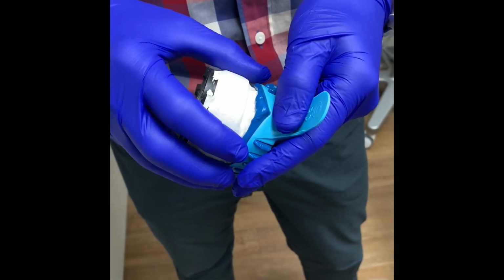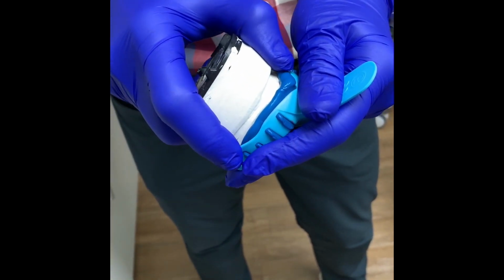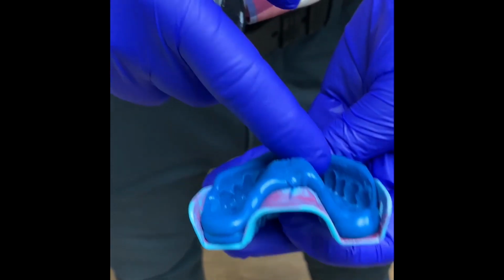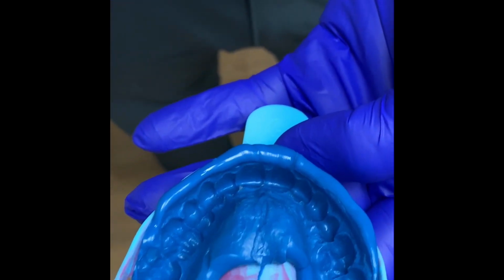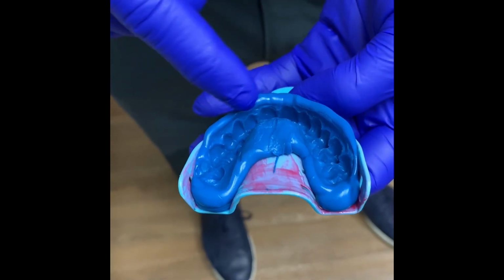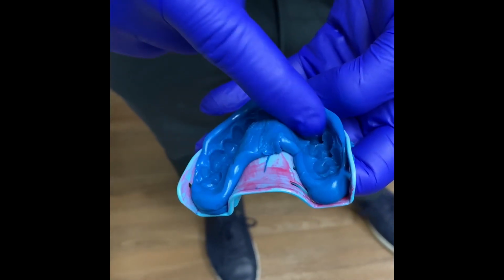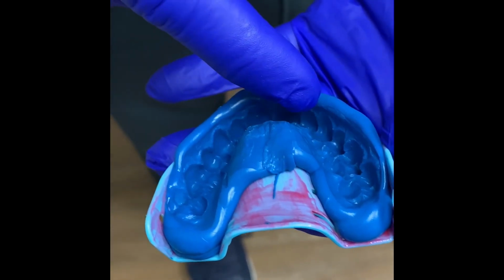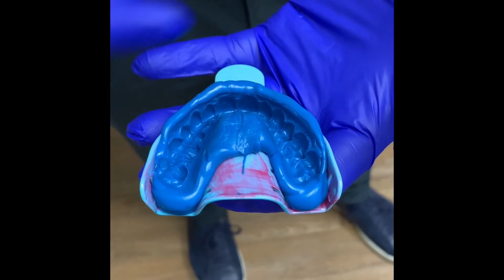So we've let it set the appropriate amount of time. You'll notice that the material is rather stiff at this point. We'll go ahead and separate it. When you look in there, you'll notice that, since we applied Vaseline to the tray, there may be some areas where you're a little bit concerned, and I'd like my temporaries to fit a little bit tighter. Remember, there's a layer of Vaseline on here. So what we're going to do next is clean this out with some alcohol and rinse it off. Then we're going to fill it with a compatible light body material, so that we can capture anything that we might have missed with the previous putty impression.